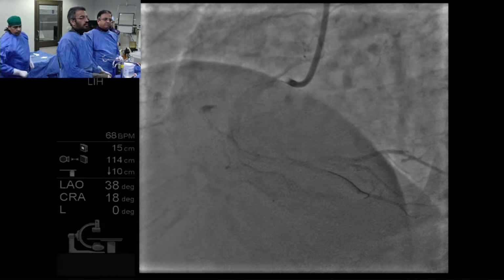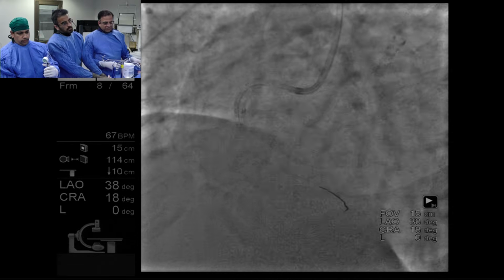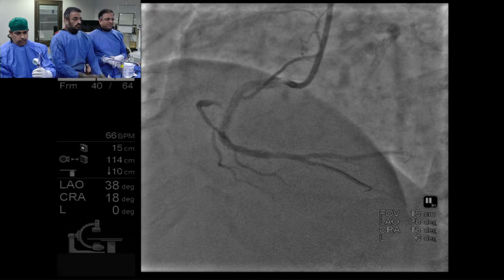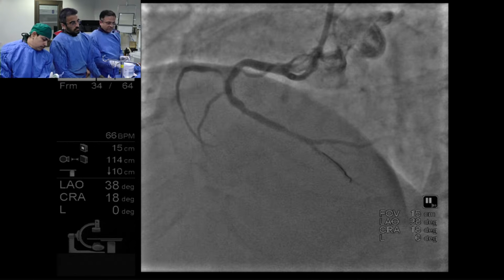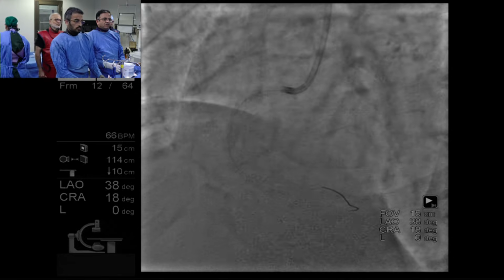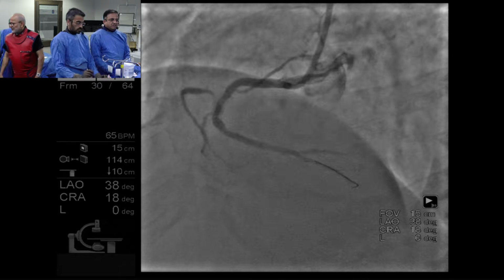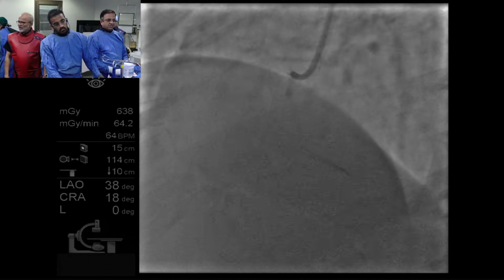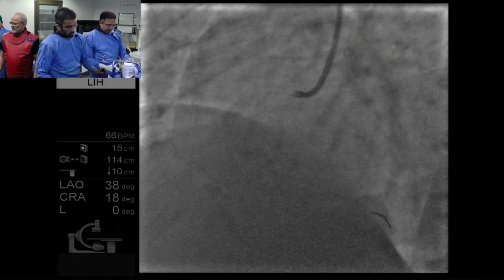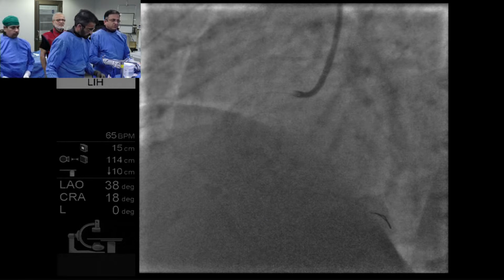Okay. The distal, we need a 3.0 by 15. Guys, we'll stick with our strategy. We're going to put a 3.0 by 15 stent distally, and then we'll do imaging. We can always make optimization changes afterwards. So let's take a 3.0 by 15 stent, deploy it distally, and then take a stab at OCT. Distal synergy, ISR chance. Yeah, you may come back and post dilate this one later. Yeah, we can post dilate to whatever the OCT says, exactly.